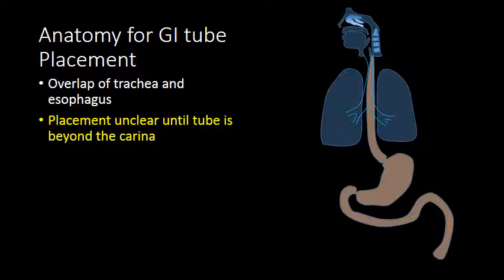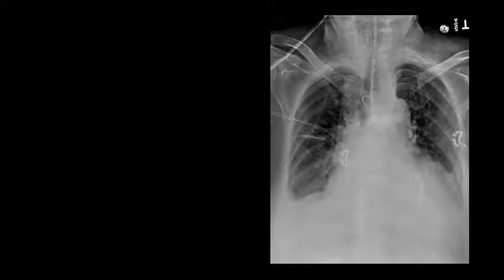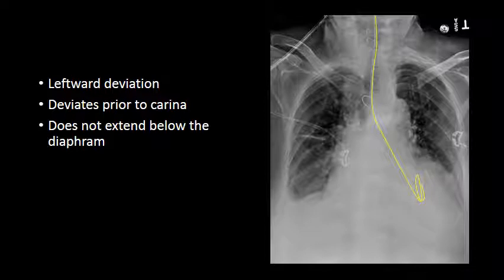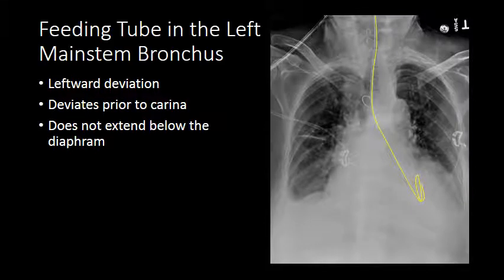Placement is unclear until the catheter passes beyond the carina, and sometimes the catheter will not go into the stomach but instead will go into the left main stem bronchus or the right main stem bronchus. Here we have an example of a catheter that was advanced beyond the carina. We can see that the catheter deviates to the left prior to the carina and does not extend below the diaphragm. This is a catheter coiled within the left lower lobe after intubating the left main stem bronchus.